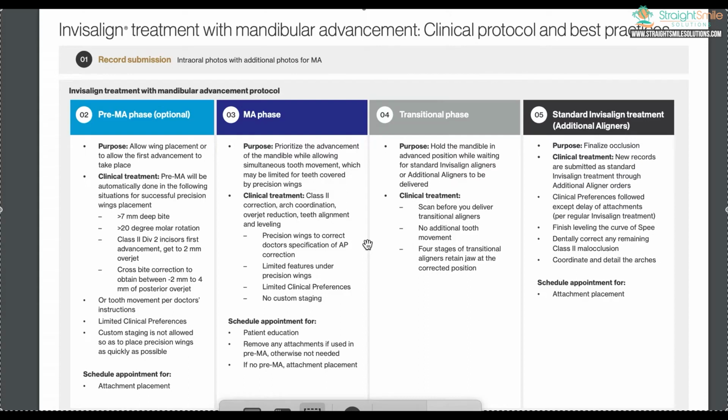You've got to ask the questions. You've got to get the growth charts. You've got to take the hand-wrist. My Phase 1 smile that I created is a huge thing. You've got to do something like that. You have to know if this is even going to work on your patient. That's not their job to make it work. It's your job to make sure you're picking a good candidate, and they're not going to screen your patient for you.